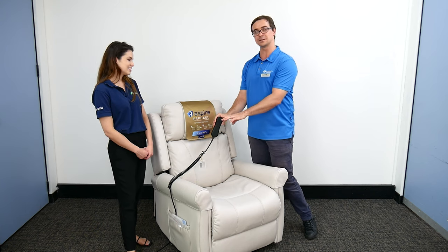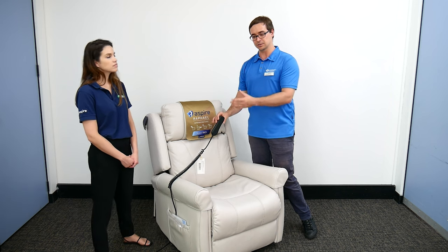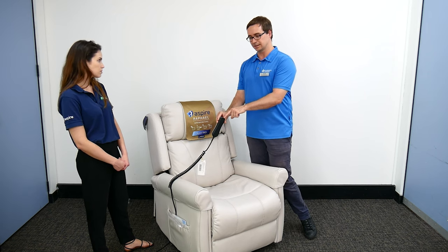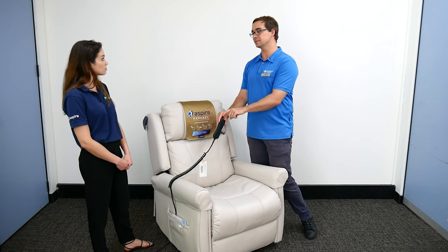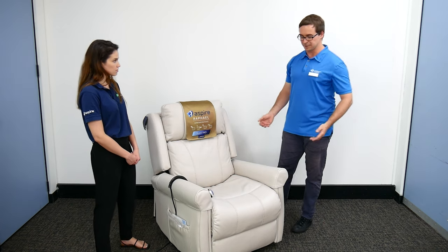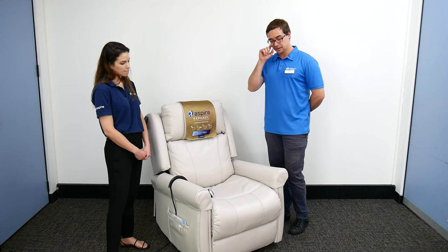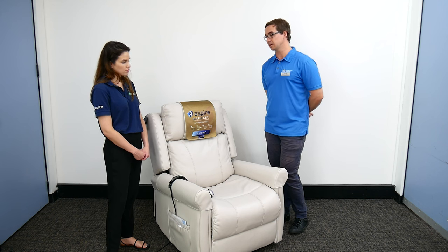People might initially think the USB port is a gimmick — just for charging a phone — but many people live with needs for assistive technology such as a screen reader or other devices for a condition they're living with. Having the ability to charge that in the place where they're seated could be quite meaningful. People living with particular neurological conditions may have a unique piece of assistive technology that this makes easy to power up.